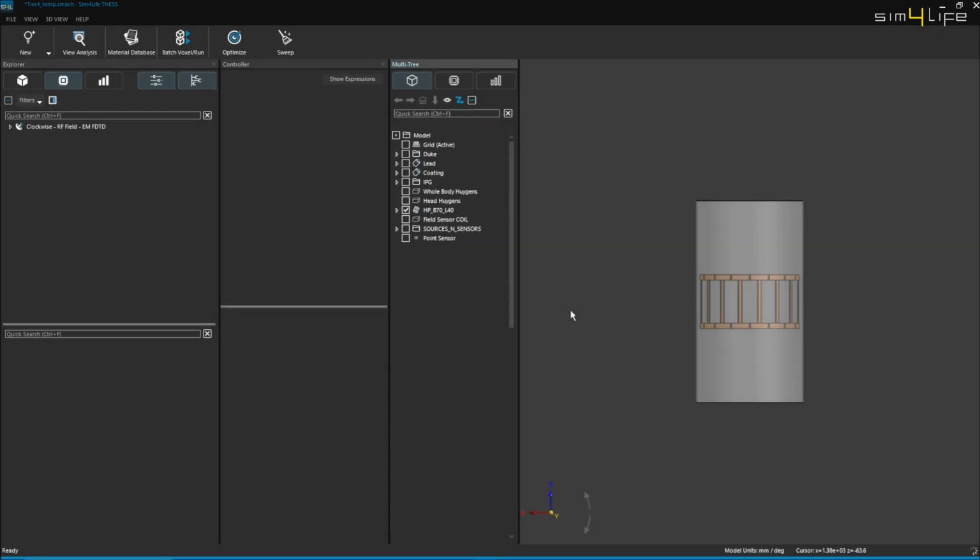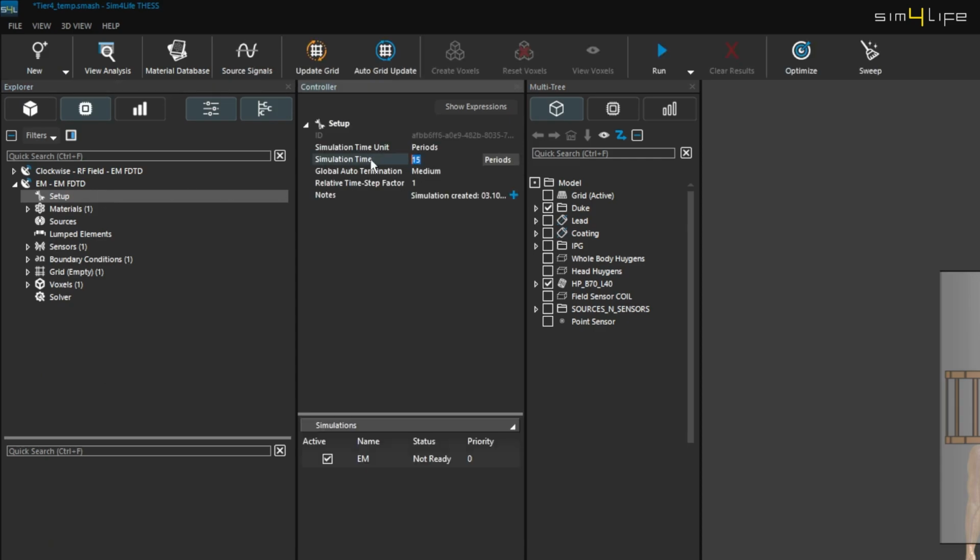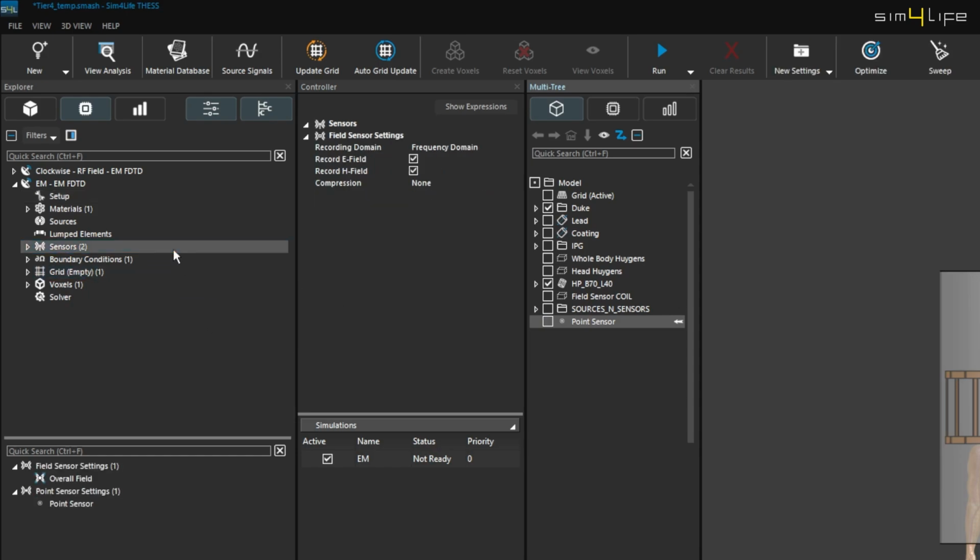Next, we prepare a simulation to calculate the whole body SAR and B1+ at the isocenter for normalization according to the International Electrotechnical Commission limits. Similar to the MRI exposure library setup, we position Duke inside the coil. We create a new single-port EM FDTD simulation with a runtime of 12 periods, sufficient for convergence, which will be validated by a point sensor, monitoring the solution stability.